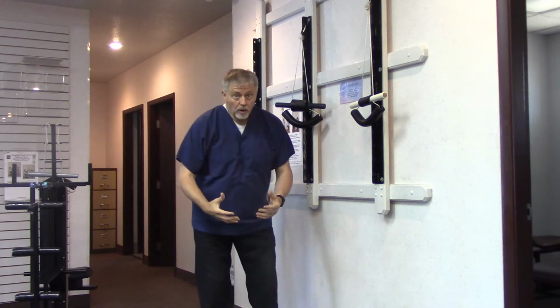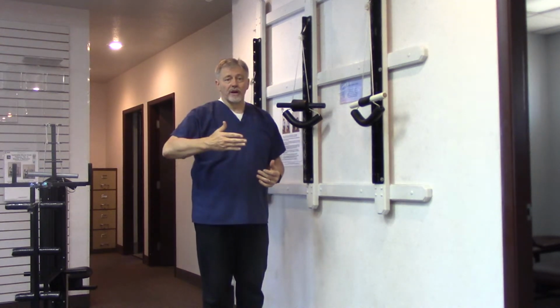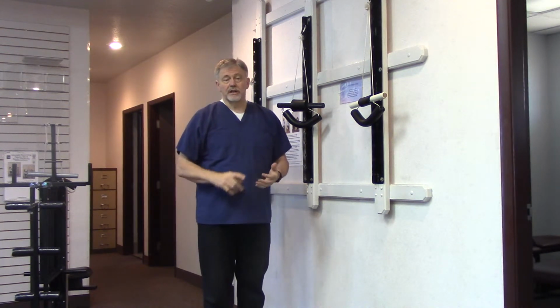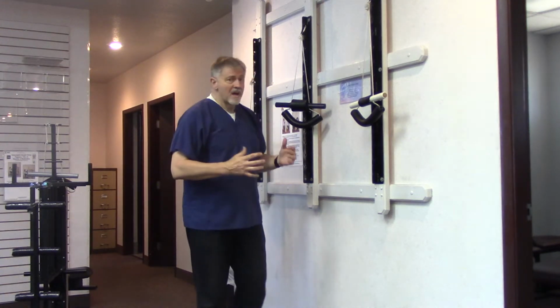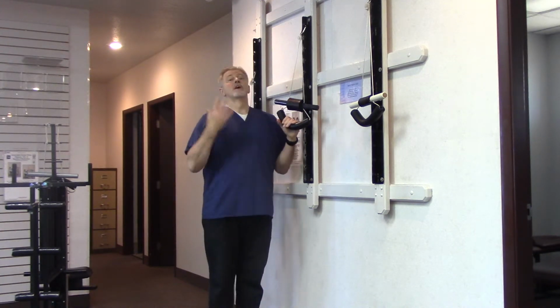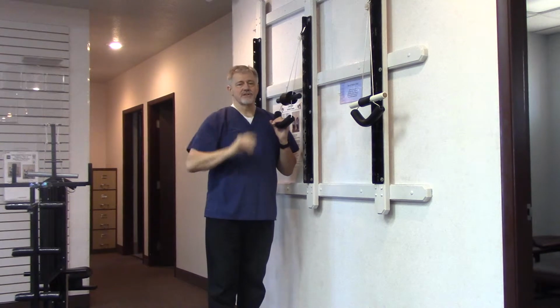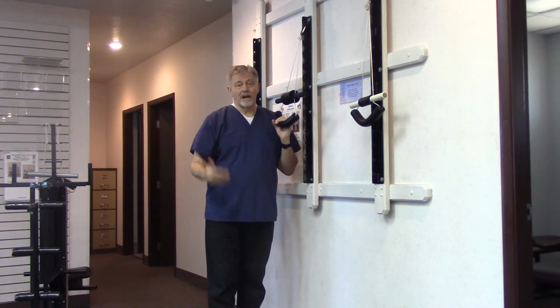Also, I'm forward all day long, working in my office. If I'm poring over reports or research papers or books that I'm currently studying and putting together projects or whatever, I'm always forward. So I have strategies, things that I do to keep me upright. And so this traction is one of my favorite ways to cause the neck to come back into that position. It also is much more effective for me when I mold.